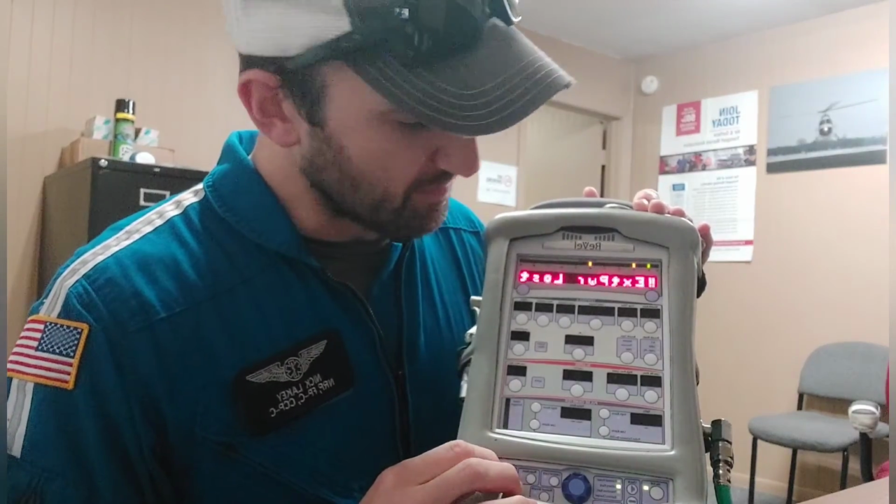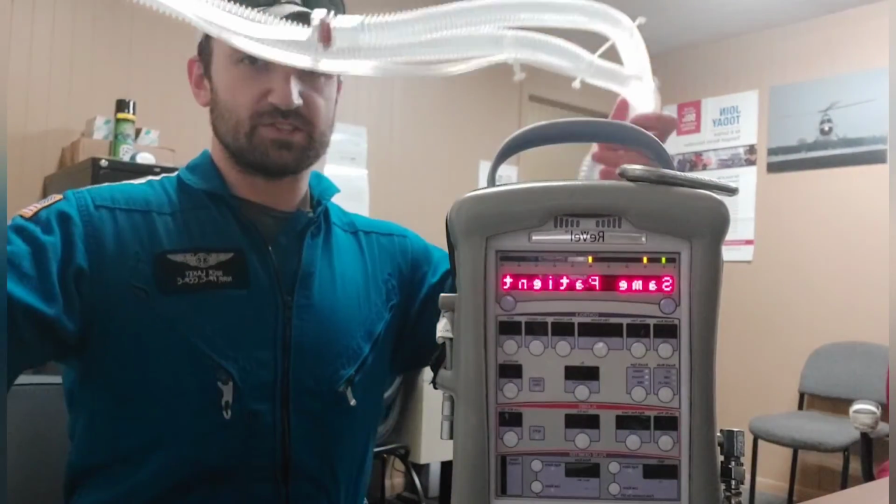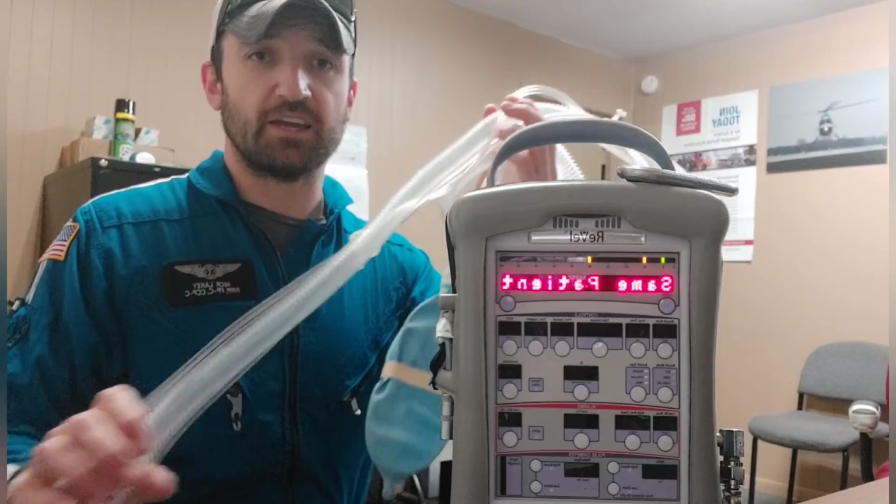So it's going to go through its power on phase. I'm going to silence the alarms here. And so I'll set this straight up. I'm going to get my ventilator circuit. So we've got the circuit here. This is what a circuit looks like.